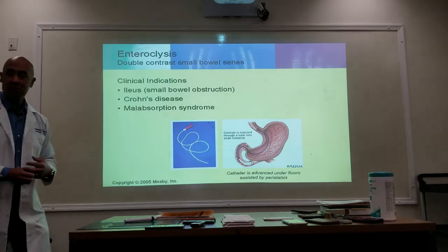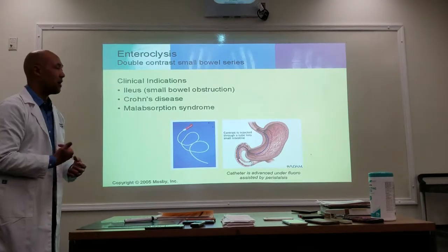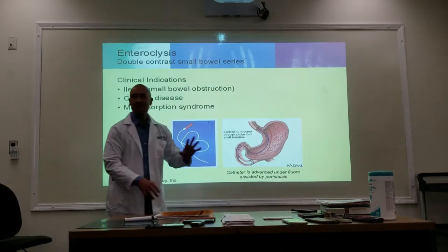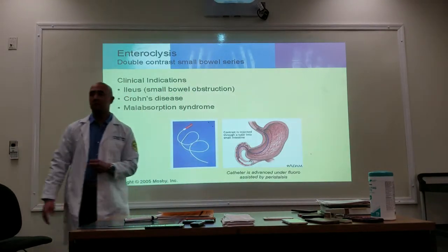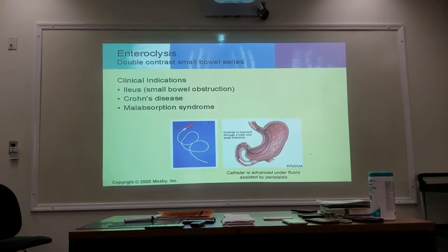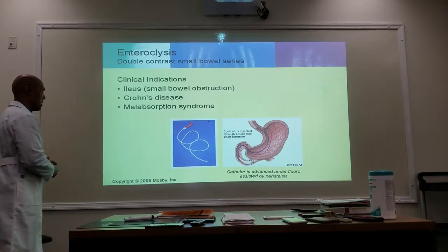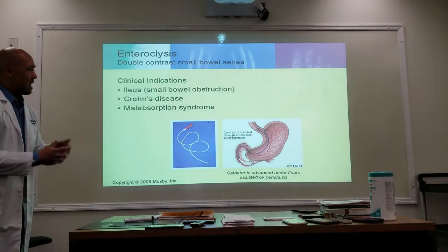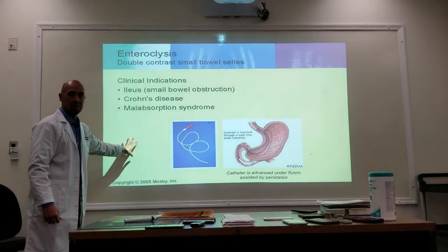So we're going to observe this under fluoroscopy. The patient is going to try to swallow the catheter, but with the aid of peristaltic activity and rhythmic segmentation, we're going to get that catheter where it's supposed to go. So this one, enteroclysis, we would do for individuals who may have a small bowel obstruction, Crohn's disease, and also malabsorption syndromes. If you recall what I said a while ago, this is done as a double contrast study.